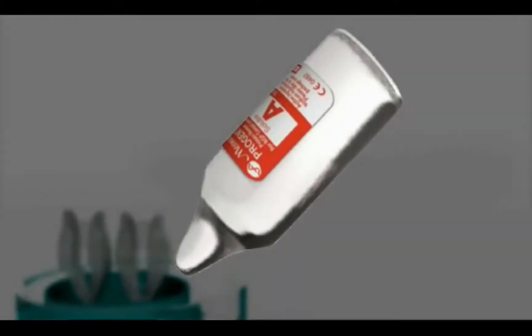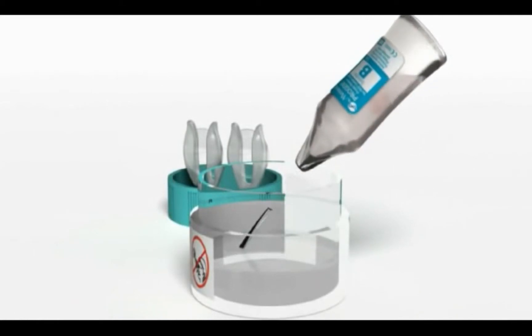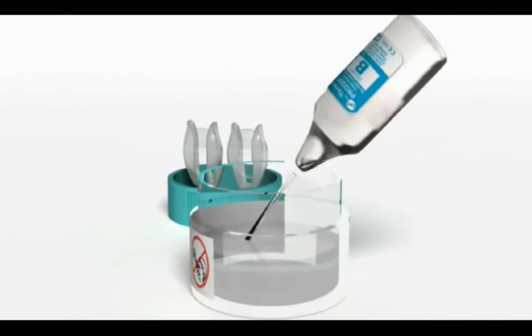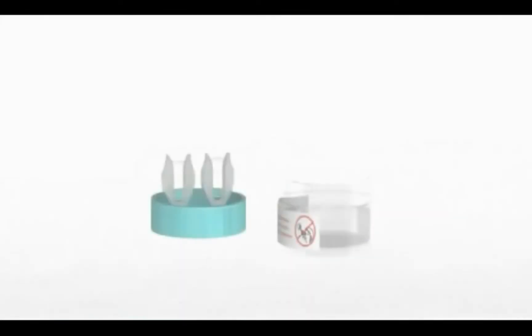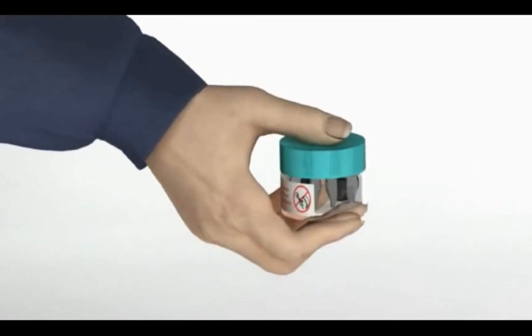Discard the ProGent A bottle immediately. Open ProGent B. Empty all the contents into the ProGent vial and discard the empty bottle. Close the cap of the ProGent vial tightly and shake gently several times.